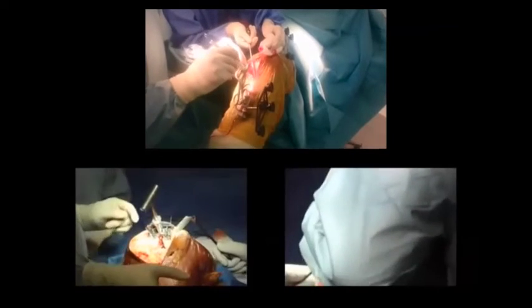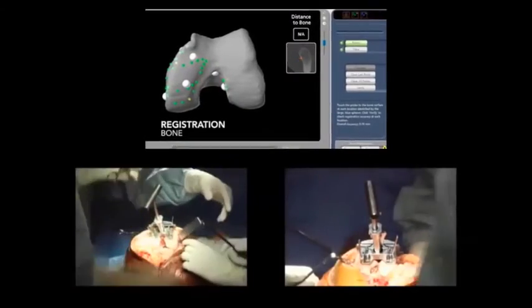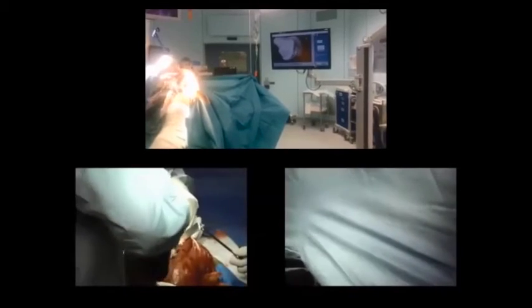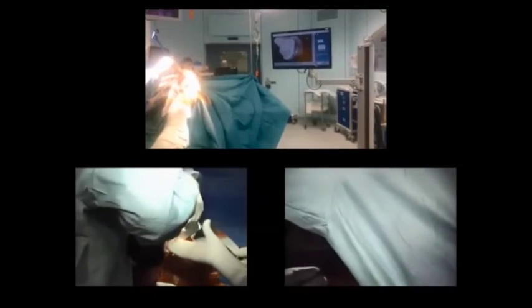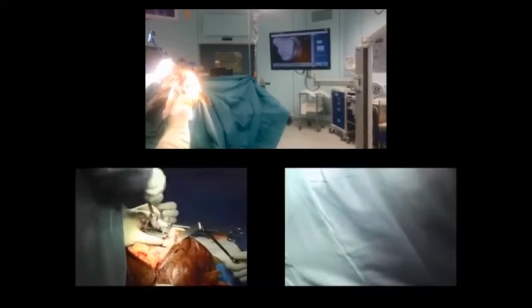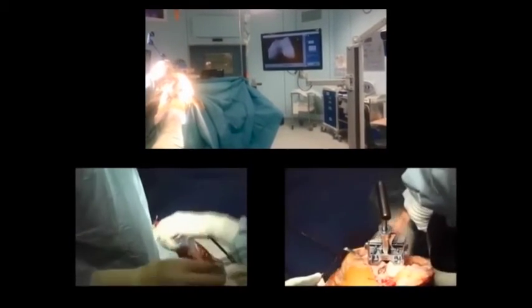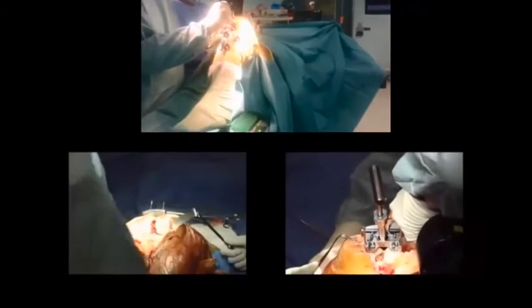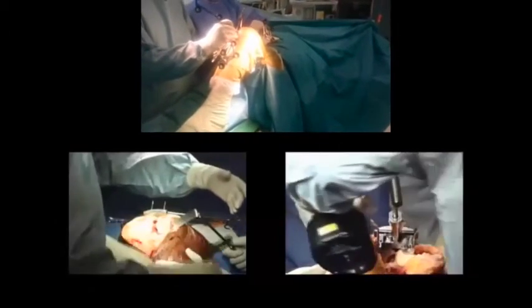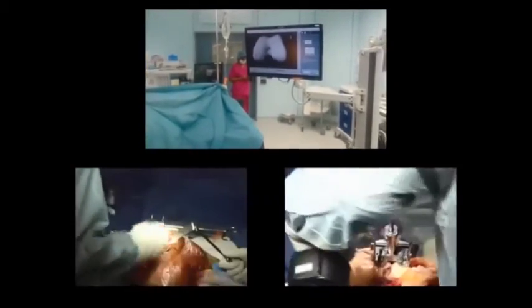We catch up here on the tibial surgery. To stress again, the left panel below is the one without tourniquet and the right is with the tourniquet. We have begun to do instrumentation of the distal femur where a rod has gone into the femur and we are beginning to cut it. On the top we have begun to register the points on the tibia onto the computer, so the scan data can now be compared with the actual patient and the system will know where we are in space.